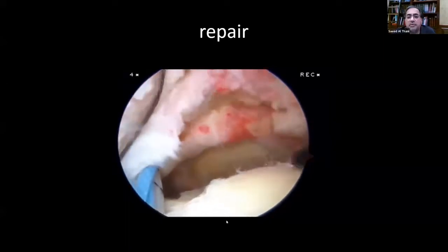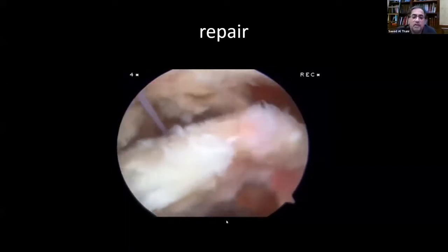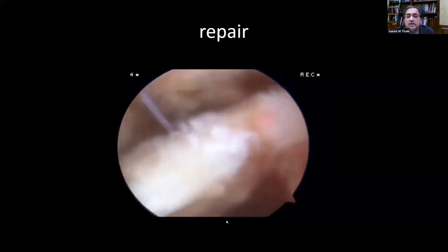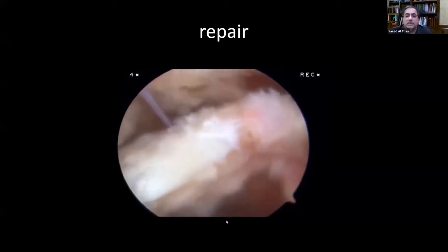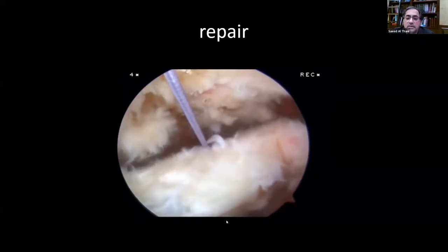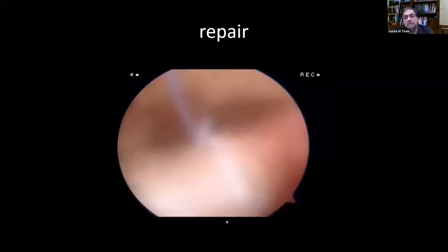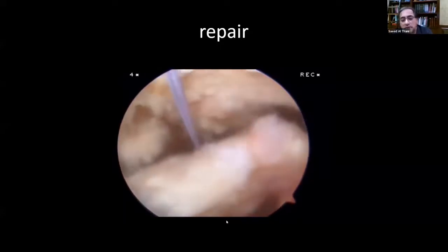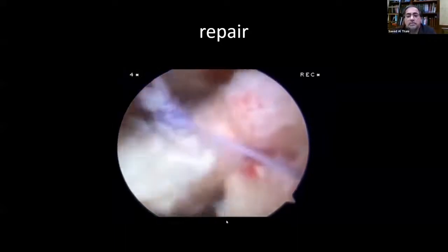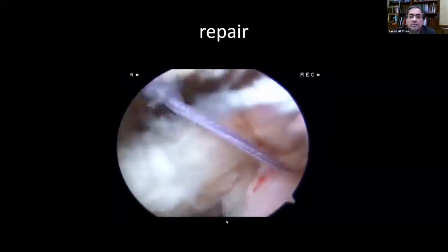You have to know where you put your suture and how you balance. And you can see down there the loop of the orthocord. And then I repair them. I tie the suture here. Usually this trick can bring the tendon where you want it, and it can help you with the major repair. It's a nice trick to repair a longitudinal split.